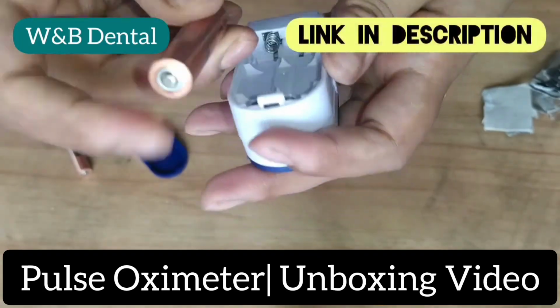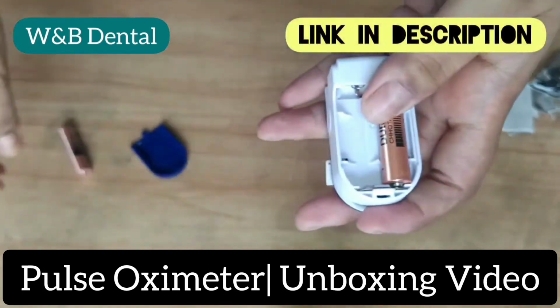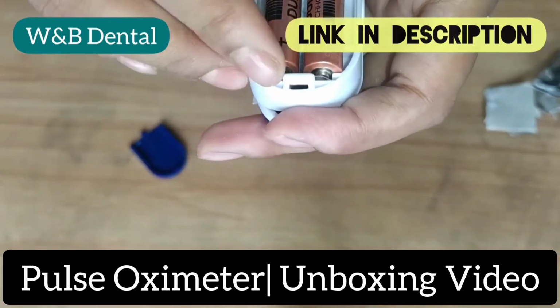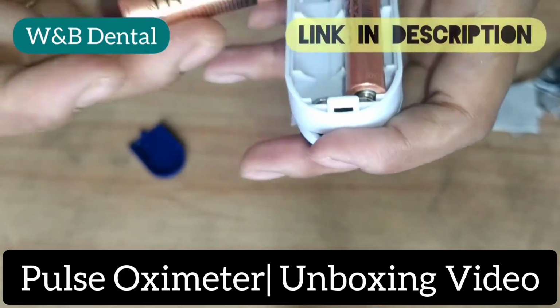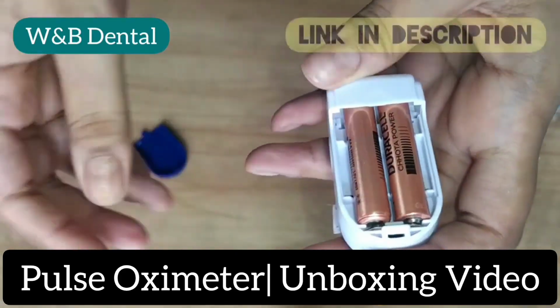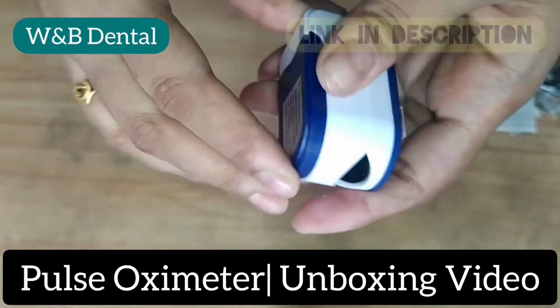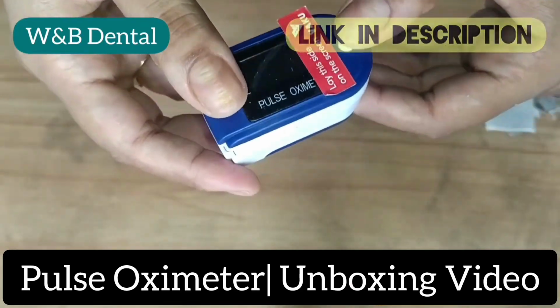Cautions are explosive hazard. Do not use the oximeter in environment with inflammable gas such as some ignitable anesthetic agents or other materials may occur. Do not use the oximeter while the testee is under MRI or CT scanning.